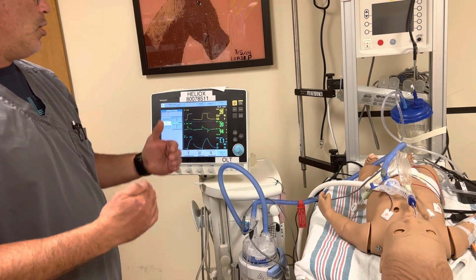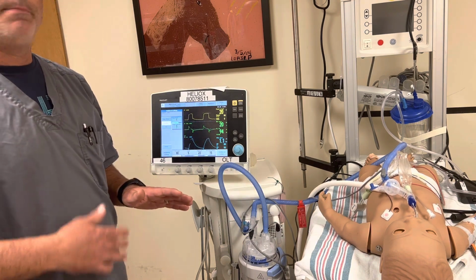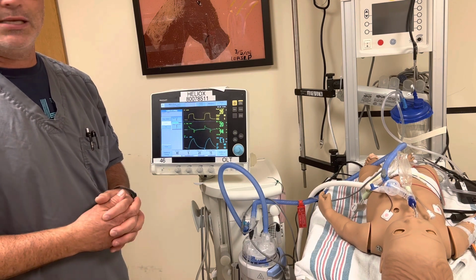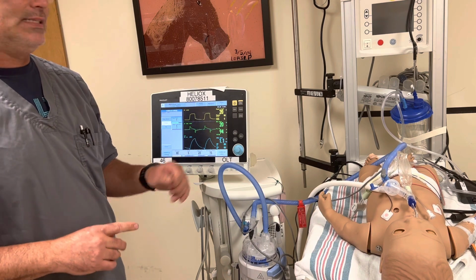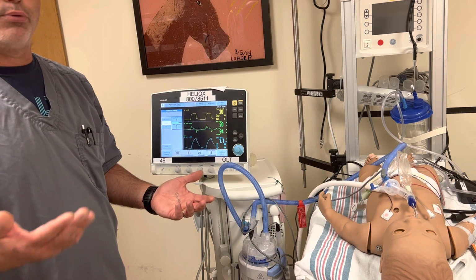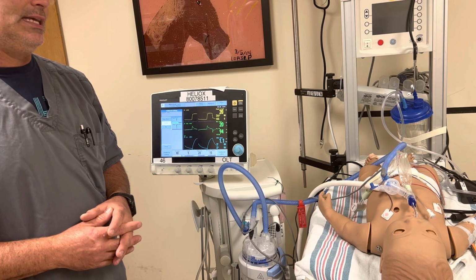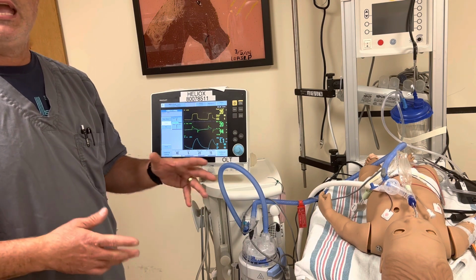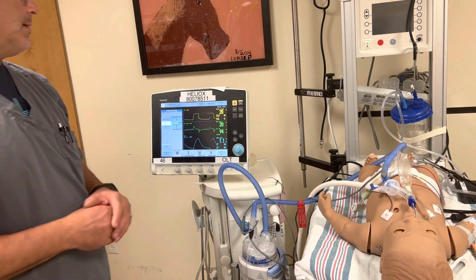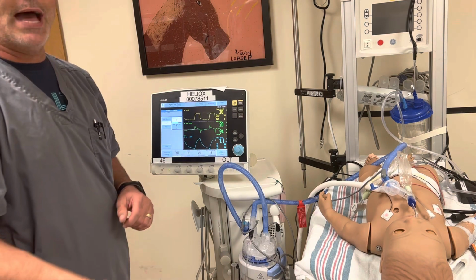And if it's enough flow through the vent circuit with your combination of how sensitive you're going to make it, the vent will start picking up those as breaths, as spontaneous efforts, and start giving the patient breaths. Now, some key ways to identify this is that if your patient is in respiratory alkalosis on his gas, but he is breathing over your set rate, that would be a possibility to look into: does this kid have a hyperdynamic pulse, and is it auto-triggering? But nevertheless, whether it's a leak or that, or something else, we're going to attempt to figure that out, and we're going to make this as sensitive as possible without that occurring.